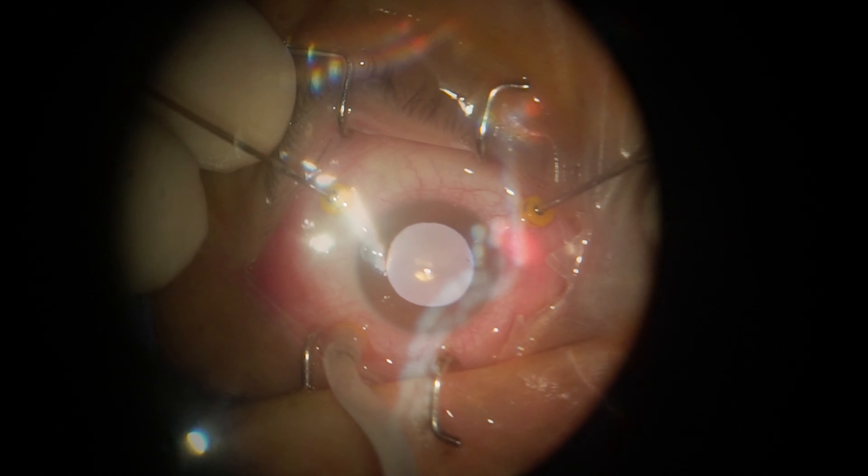Of course, the lens should be watched at all times and the eye should be turned towards the direction of the cutter so you move the lens away from its shaft.